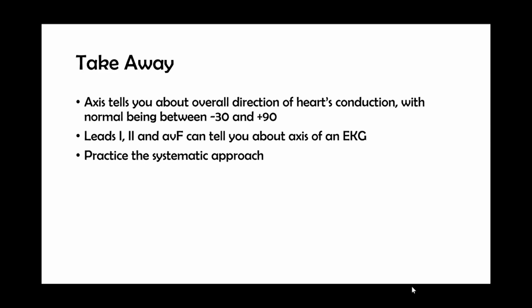All right, so the takeaway messages. First of all, I know axis can be a little bit intimidating. It's one of the more intimidating things about interpreting EKGs. I think with practice it gets a lot easier, and it makes a lot of sense if you take the time to understand the concept and why we call certain things left axis as opposed to normal or right axis.